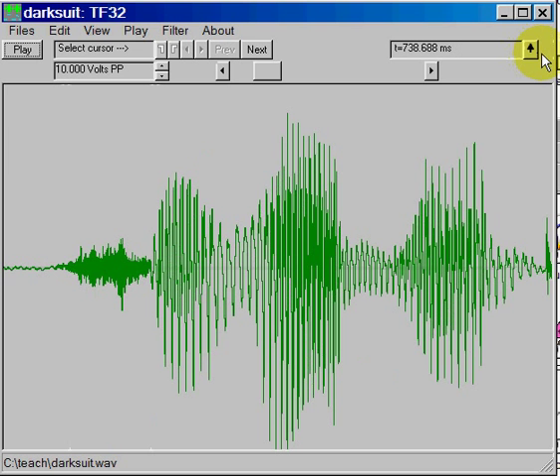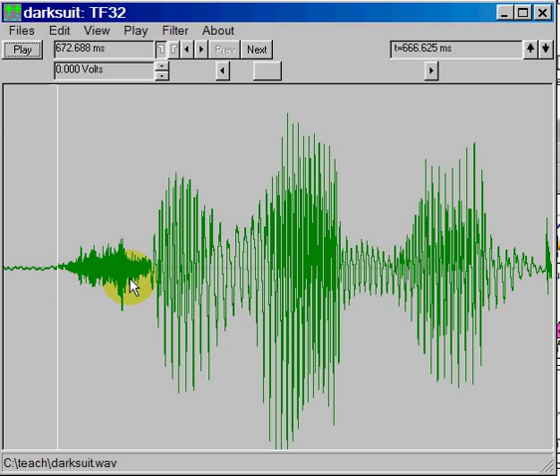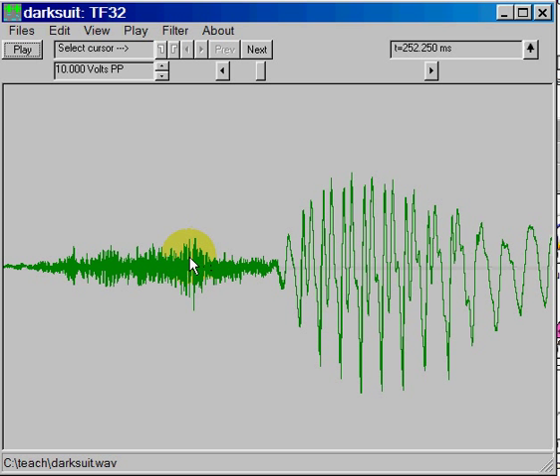Once you are expanded in on a particular region, you can also continue to look at other parts of the speech sample without having to compress back out. If you look up here, you have a small box between a left and a right arrow button, and that box shows you relatively where the window is in the overall file itself. So you can drag this along and look at upcoming segments in the file.